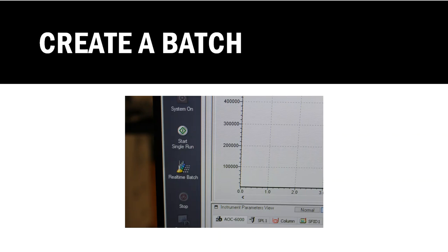Alright guys, so in the last video we talked about how to create a batch, and a batch is for a batch of samples. So you want to run more than one thing at a time, and you want to go over and load maybe 30 or 40 things up for the instrument to run, and then you walk away and you will come back hours later when it gets finished. So that's basically what we are after, and in the last video I showed you the steps of that process on how to create a batch table.